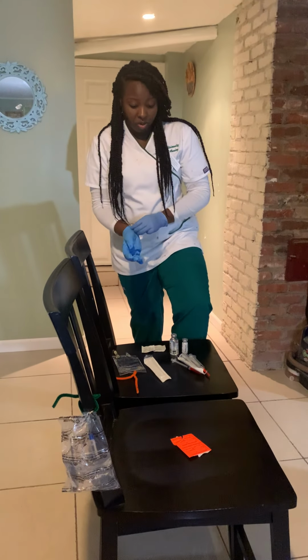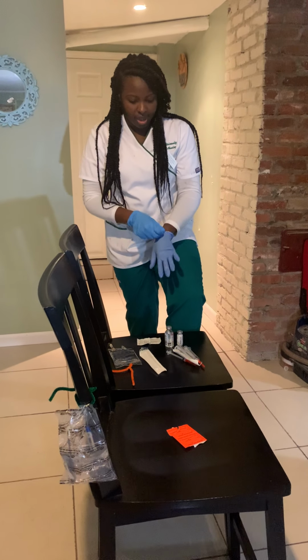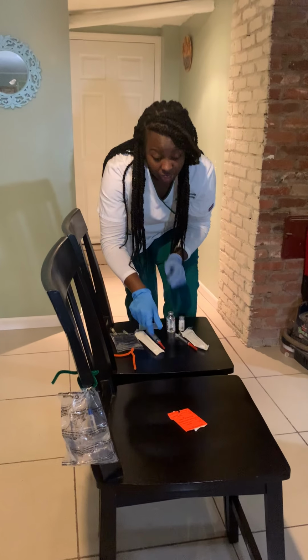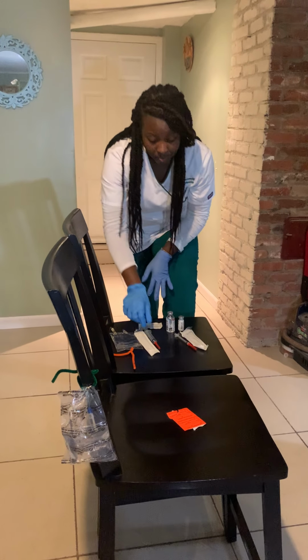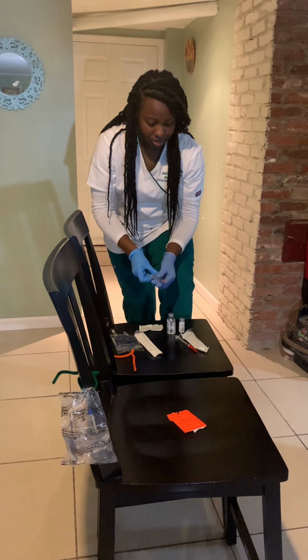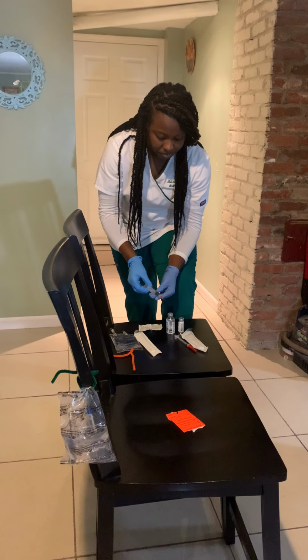So now going forward, I have the syringe here. This is a 12 ml syringe, and I'm going to uncap and pull in air to 5.6 ml.